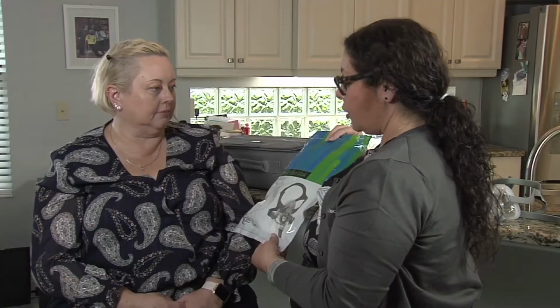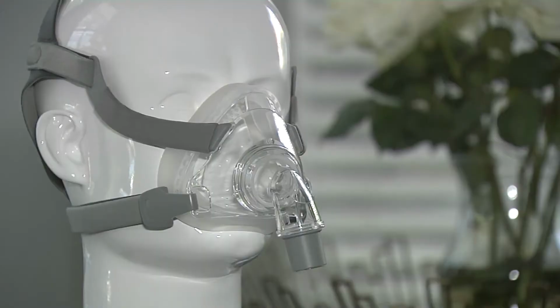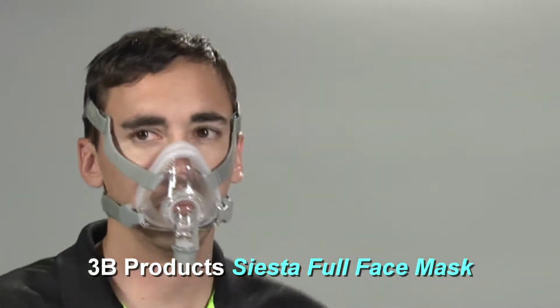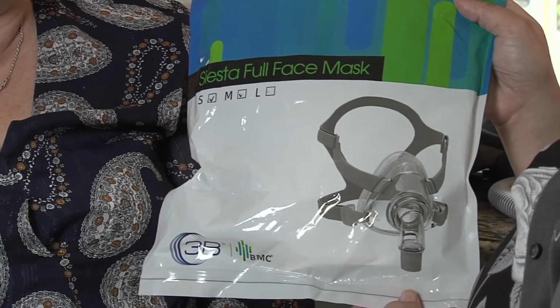All right. Your doctor has indicated that a full face mask may suit you best due to your sleep position, being mostly on your back or side, and also the fact that you have nasal congestion due to allergies. This is the mask we've selected to start with. This is the Siesta Full Face Mask.